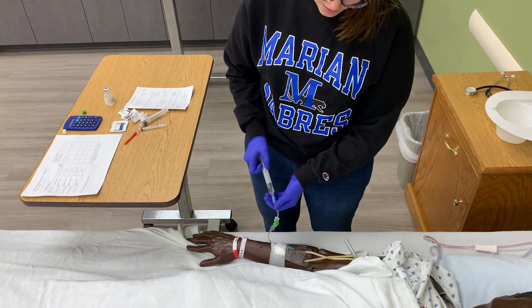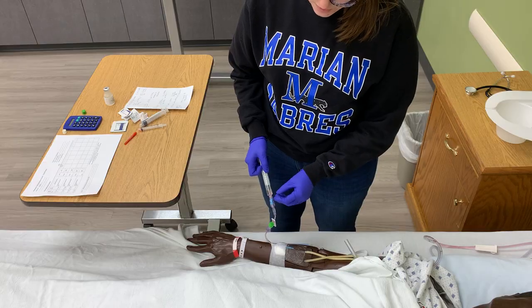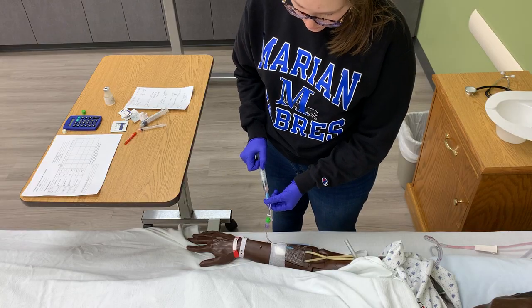Okay, we have just a couple mLs left, so we're going to leave 0.5 in the syringe so that we don't bottom out the clave.